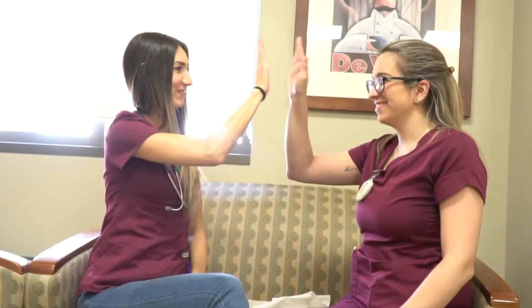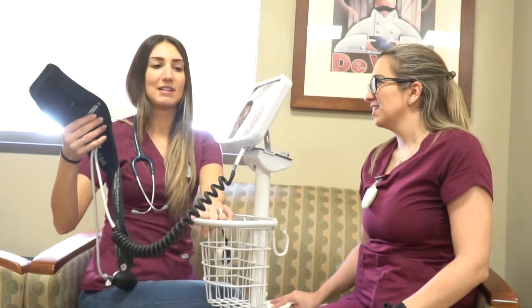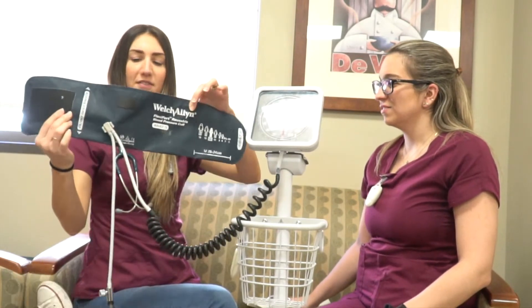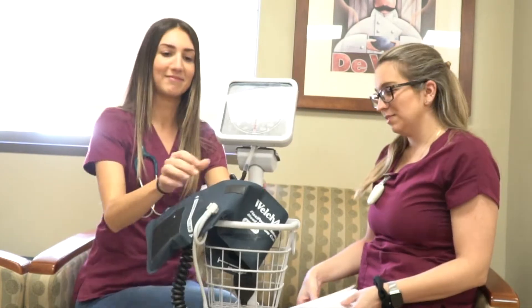Let's get started with the parts of the sphygmomanometer, which is the BP machine. First you have the cuff that you wrap around the patient, then you have the dial with the numbers there to the right, the bulb that you pump, and then the air valve that you release.